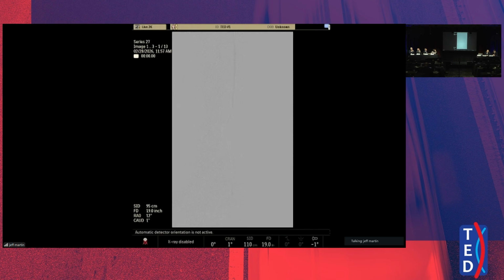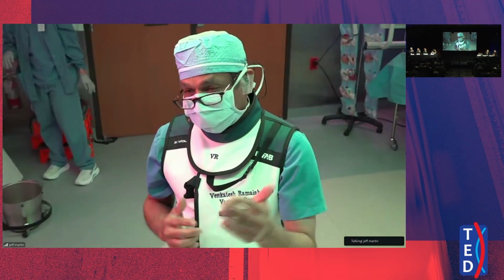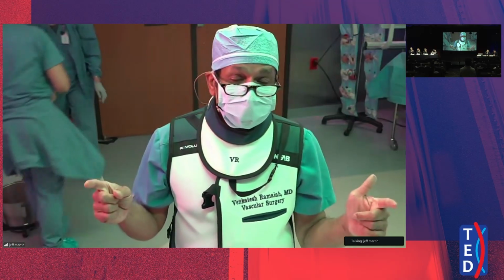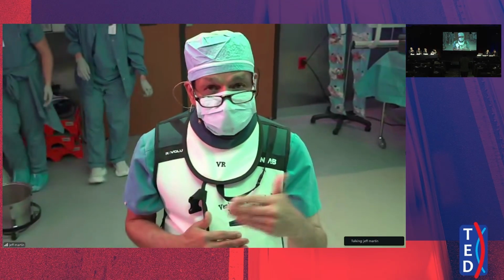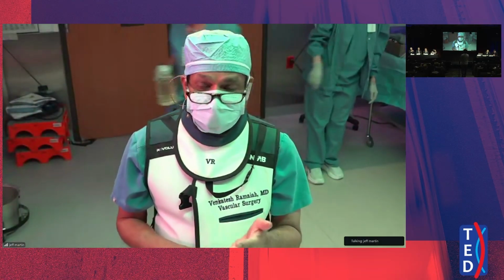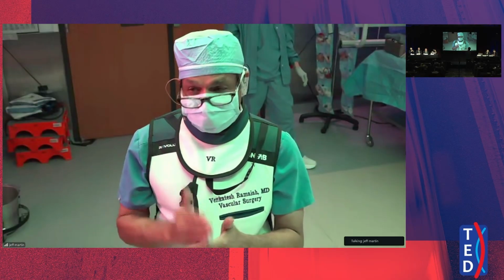Single posterior tibial. So yes, you can debate this all over again, because when I punctured the SFA, I could probably open the native SFA too. But again, opening a 40, 50 centimeter long occluded SFA popliteal, sometimes the patencies are not very good. You may go subintimal and it's even worse. But I think PTAB is an excellent example for these long segment SFA popliteal occlusions. You can do them through stents. You can do them for flush occlusions.